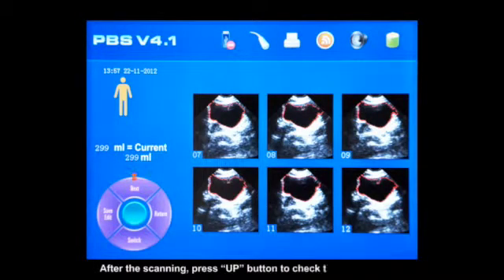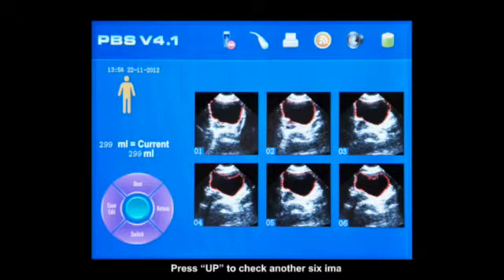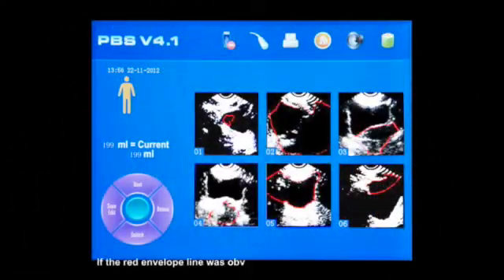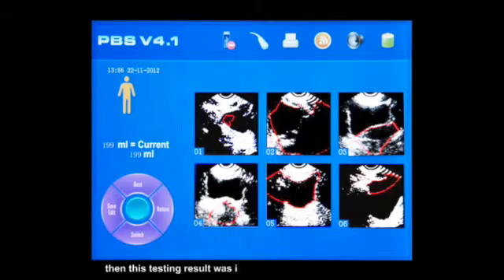After scanning, press the up button to check the first 6 images. Press the up button to check a further 6 images. If all 12 images show a red envelope line, then you have an effective result. If the red envelope line was obviously smaller or bigger or deviated from the bladder edge, then the testing result was ineffective and you need to do a rescan.